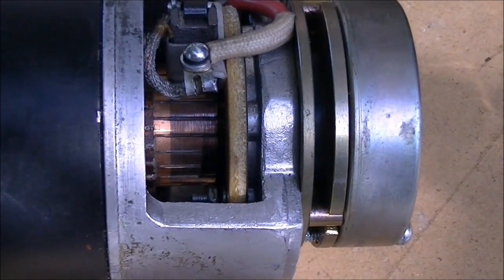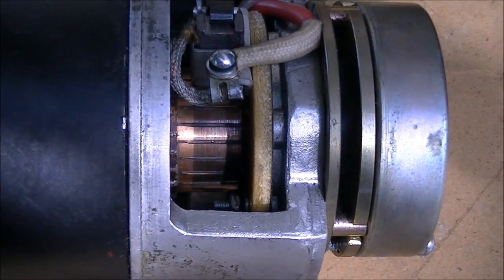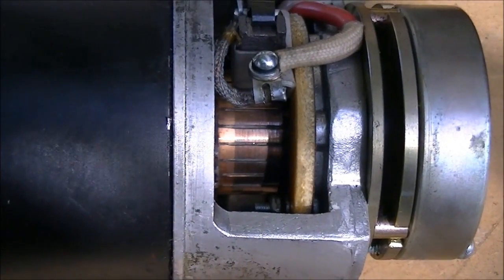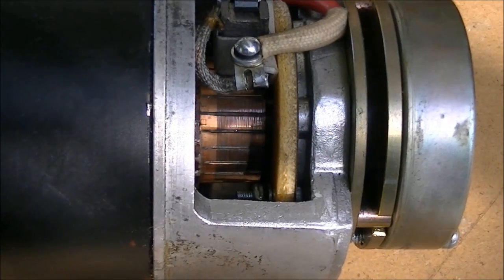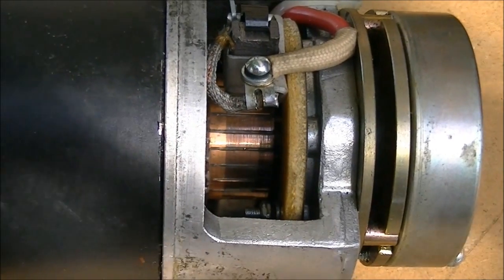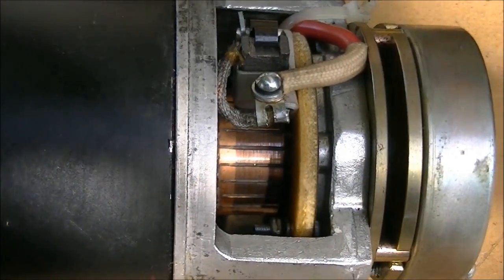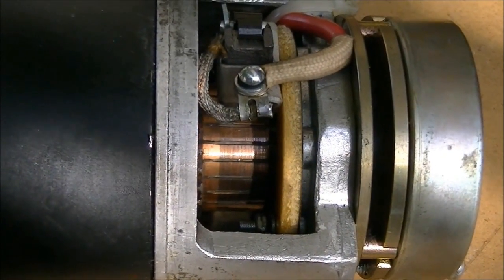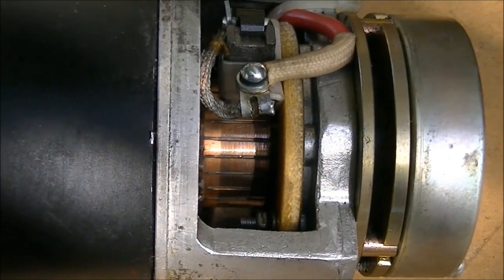Hi folks, we're looking inside one of my wheelchair motors — I took the cover off. Looking at the commutator right now, it really needs to be resurfaced for full power and smooth operation, which isn't something I'd be able to do. So I'm going to clean that commutator a little bit with alcohol.